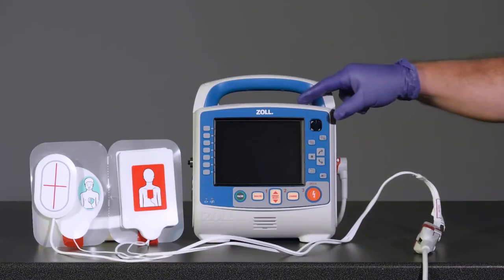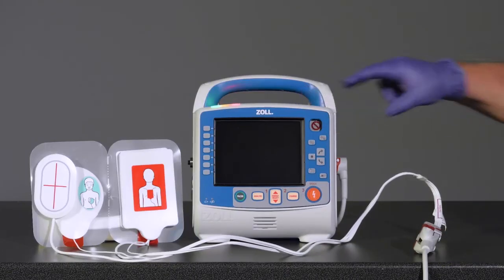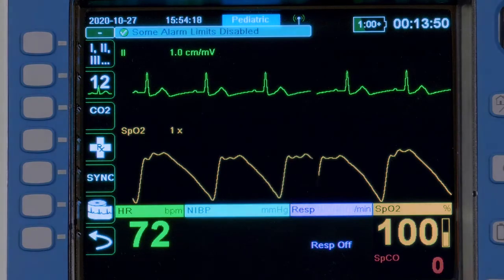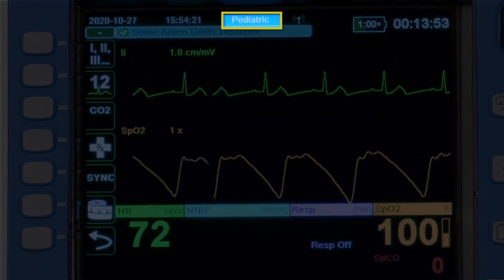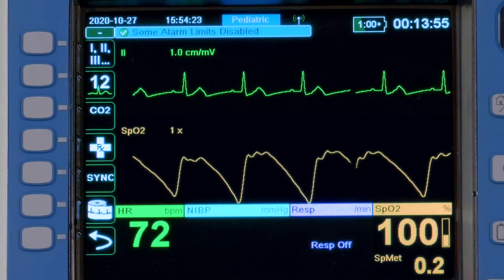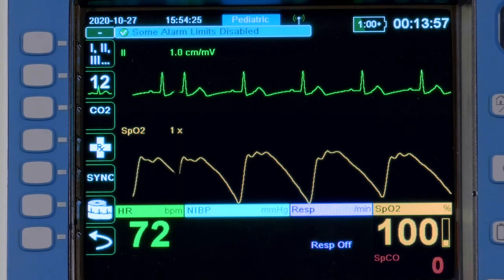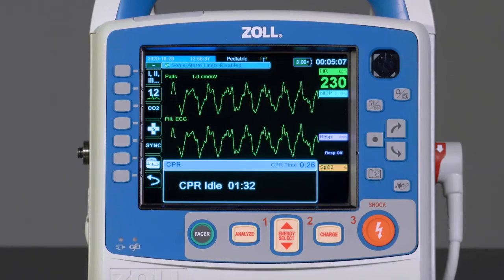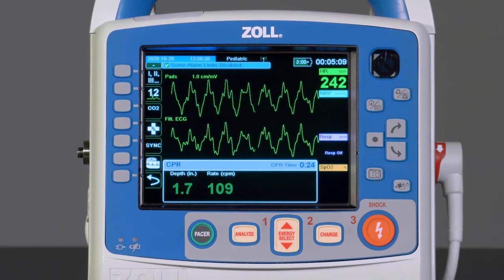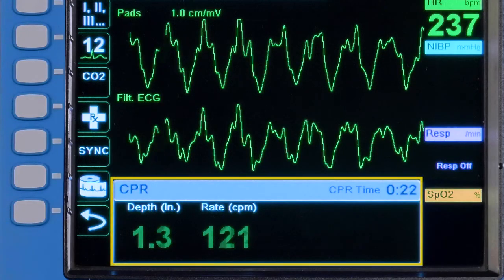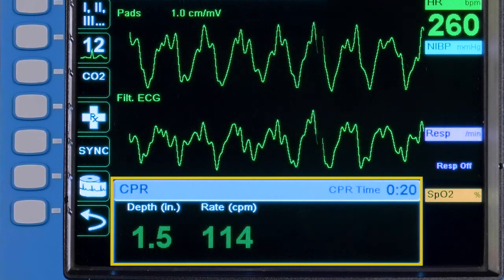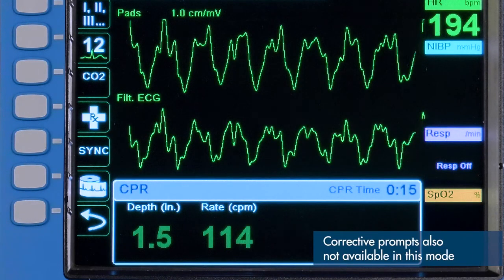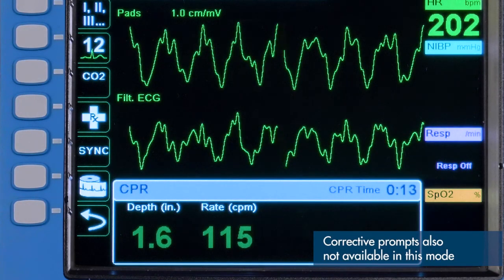If ZOLL's pediatric one-step CPR electrodes are connected to the X-Series Advanced, the device will automatically switch to pediatric mode, giving the provider all of the previously discussed benefits as well as enabling pediatric CPR feedback. Pediatric mode with one-step CPR electrodes provides the CPR dashboard that displays depth and rate feedback only. Note the release bar and perfusion performance indicator are not available in pediatric mode.